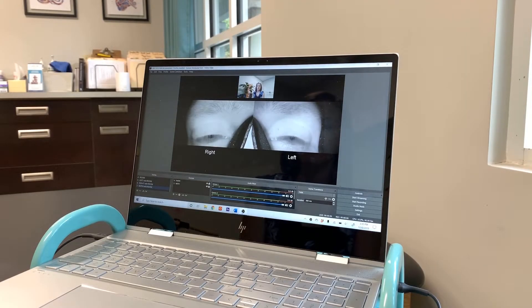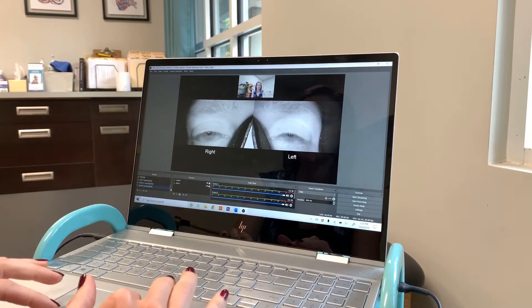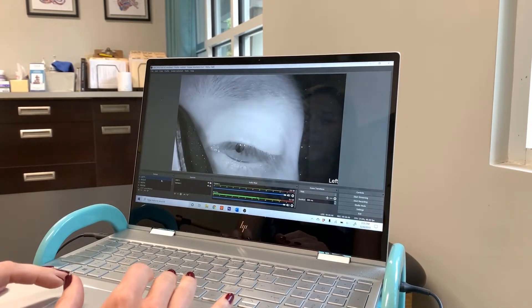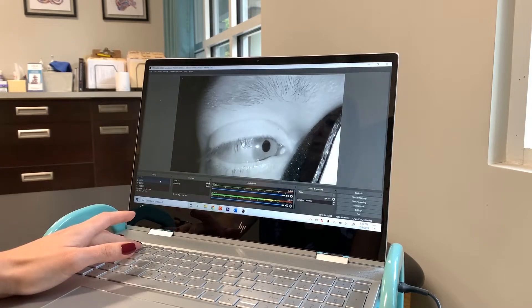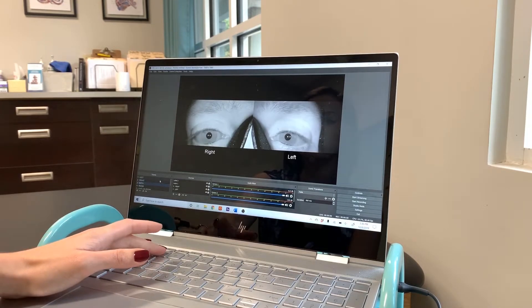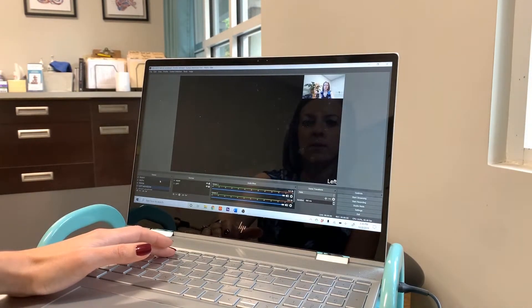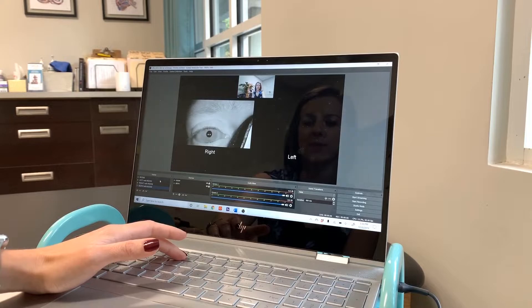The software for Vestibular First was very easy to download and set up. They did a really good job on their website putting together a step-by-step tutorial on how to set it up, what settings to use, and the recommendations. Once you pull everything up, you have a few viewing options: you can look at just the left eye, just the right eye, or both eyes. You can also view just the room, the left eye with a room view, just the right with the room view, or both eyes with the room view.